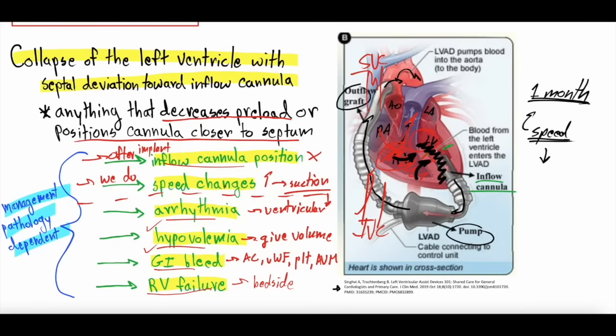Suction events can be caused by a diverse array of things. The common themes, though, are a change in cannula position, a change in speed, or anything that is going to decrease the left ventricular preload. Okay? These are things to think about and to evaluate for.